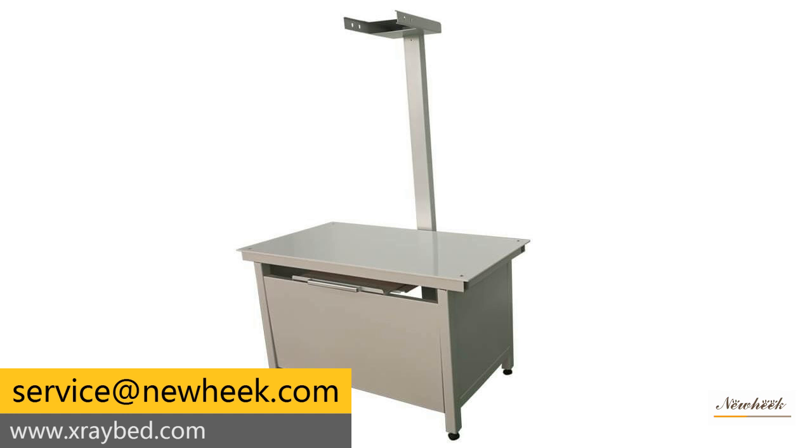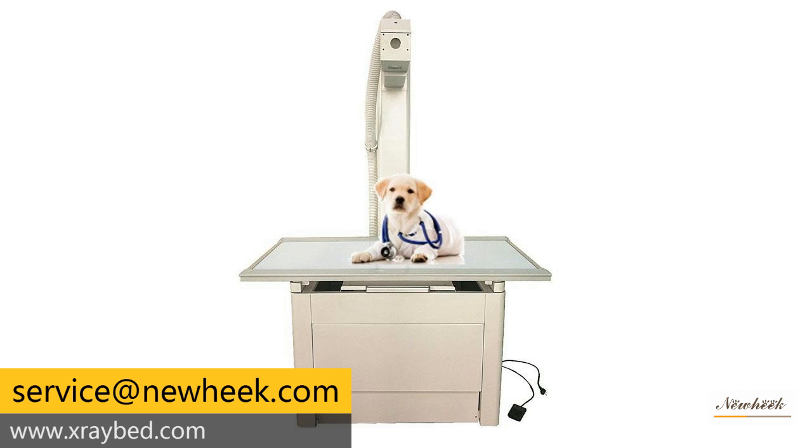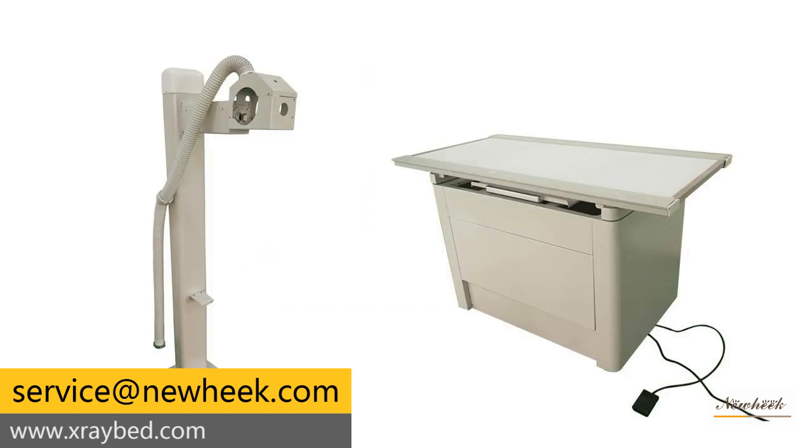Advantages of x-ray machines for animals include: one, quick and short time imaging with higher work efficiency — no need to wash the film, with direct computer imaging; two, multiple functions of automatic protection and fault prompt make it more safe and reliable to use; three, the shooting mode specially developed for animals is simple and clear in operation, safe and convenient in use.